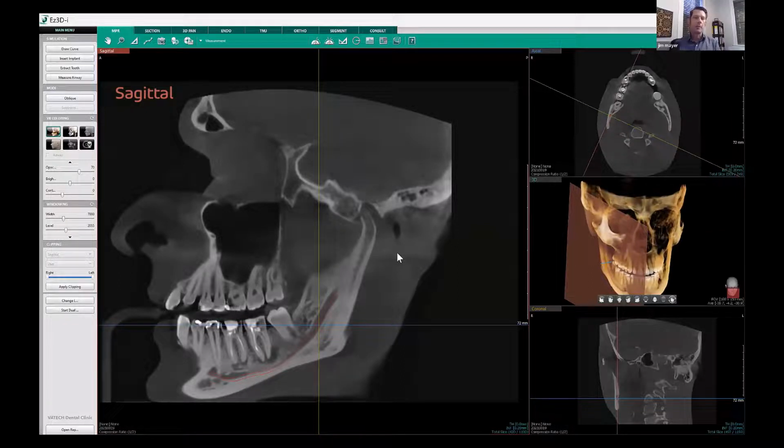As you pointed out, I call it the targeting system, but also being able to manipulate the data at an angle to be able to view different structures that you're looking at on there. Absolutely. Well, thank you for taking us through that.